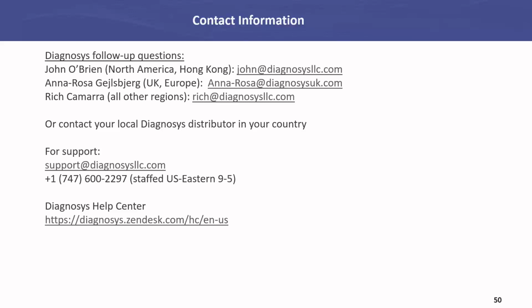So I see some questions are starting to roll into the chat. What electrode do we use to record the VEP? The responses that I showed earlier were recorded with just a needle electrode subdermally across the midline in the back of the head.